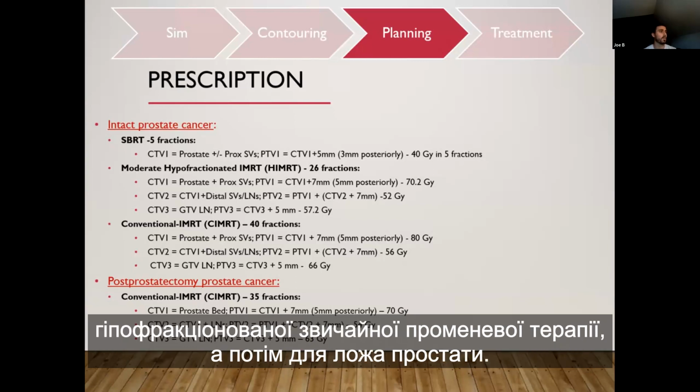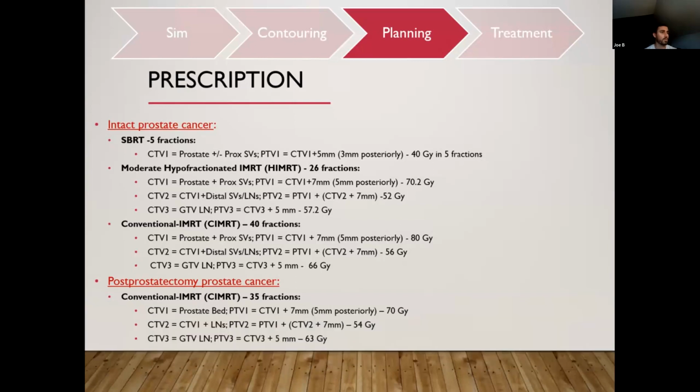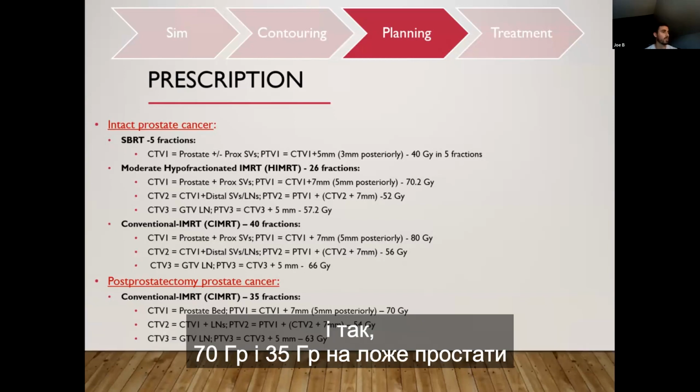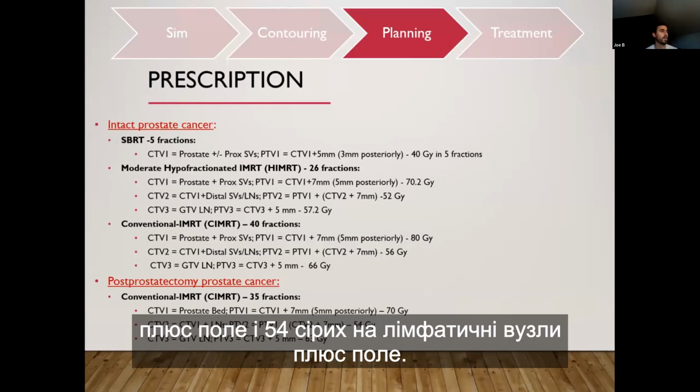And then for prostate bed, I actually just planned a case this morning for Mark, and yeah, 70 gray and 35 fractions to the prostate bed plus margin, and 54 gray to the lymph nodes plus margin.